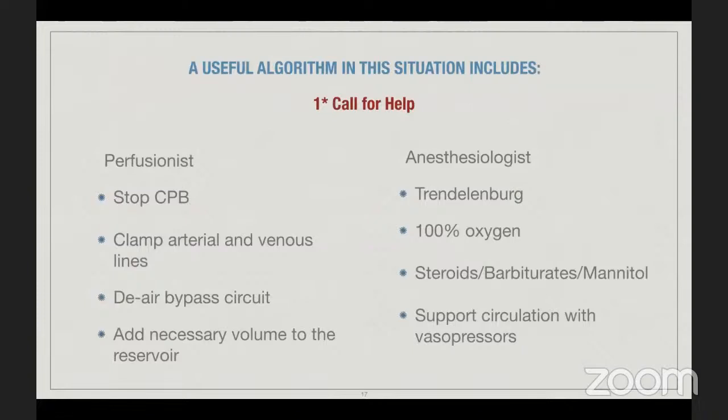Before you go to the management, do you know of any other sources of major air embolism that can happen during bypass other than the venous reservoir? Disconnection of the line or breakage of the line or the tubing? Breakage will cause blood spillage. It will not usually cause air to go in because you have blood going out. Inappropriate cross clamping with the open cardiac or intracardiac procedure? Yeah, that can happen.